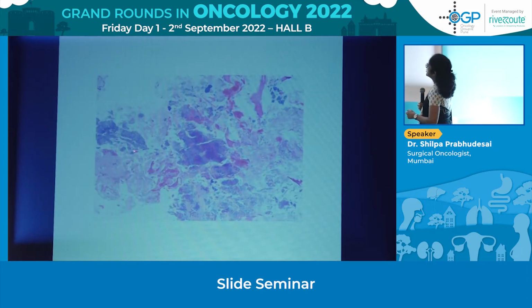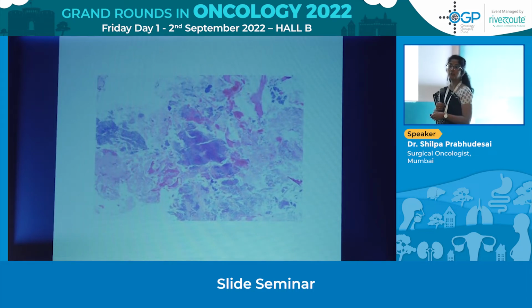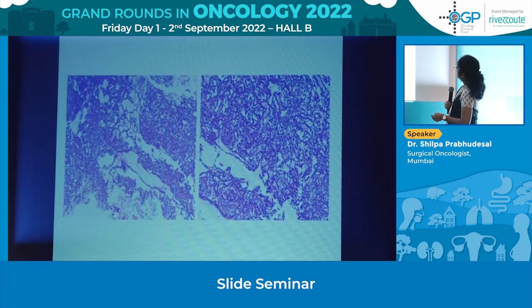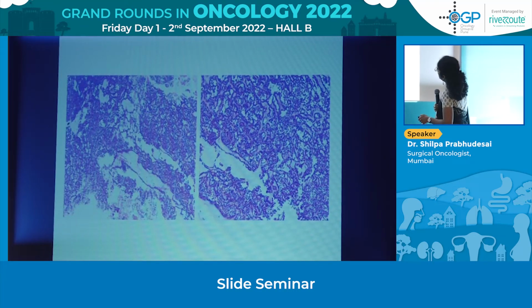Again, pieces of a tumor, almost looks like what I showed you before. Again, a blue basaloid looking tumor, fragments of bone. This part looks a little more solid compared to here. Here some kind of spaces seem to appear, maybe cribriform, and one wonders whether there is some glandular pattern. And when you see here, this looks like an edematous papilla.